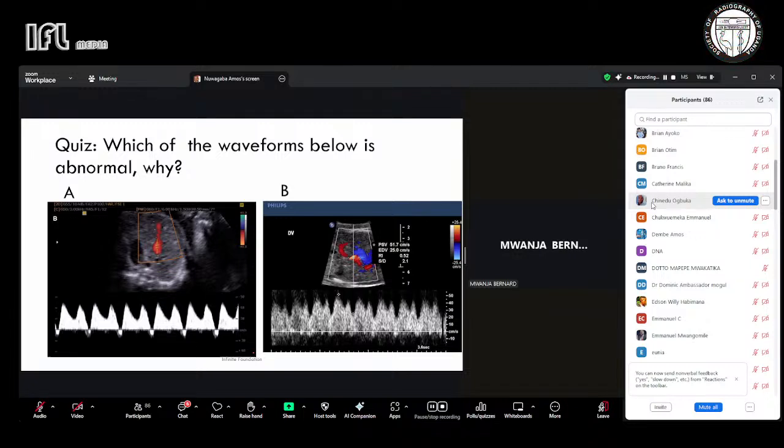Mr. Mwanje is saying A is abnormal, so that means B is normal. Would you like to tell us why? Okay, Mr. Mwanje, please unmute and try to give some explanations for your answer.